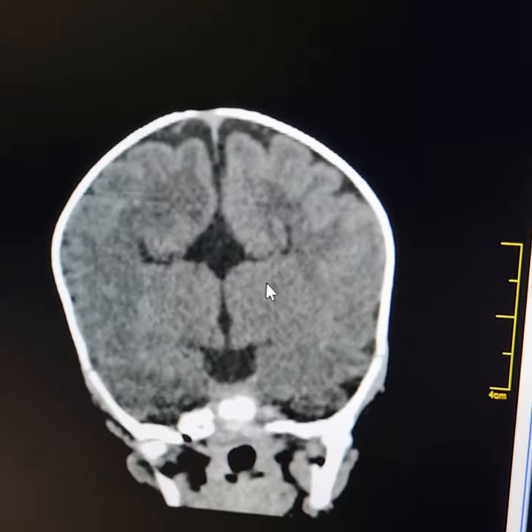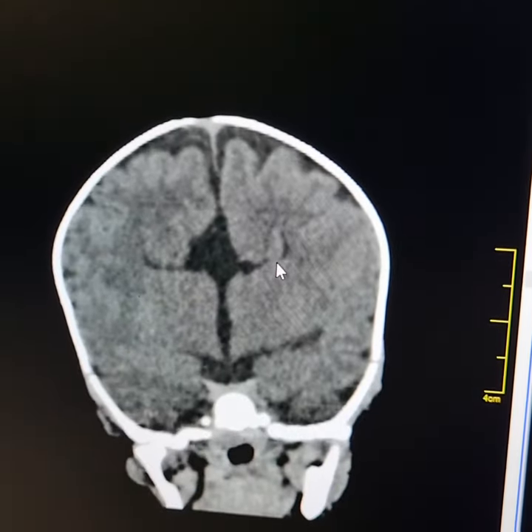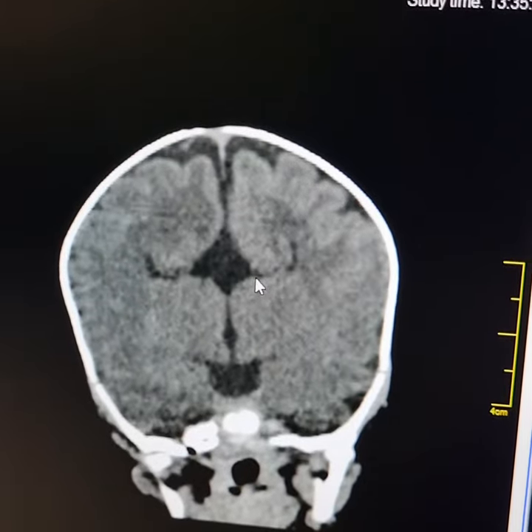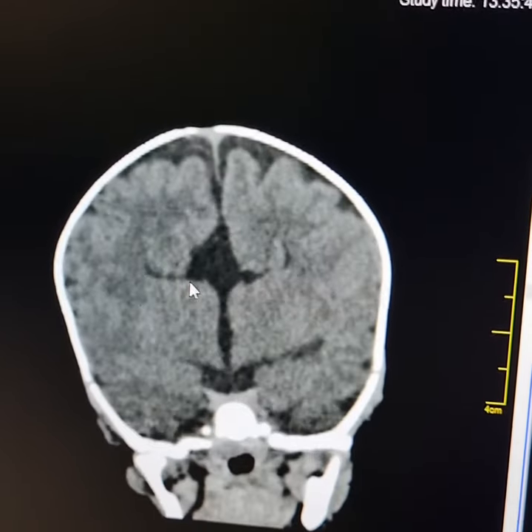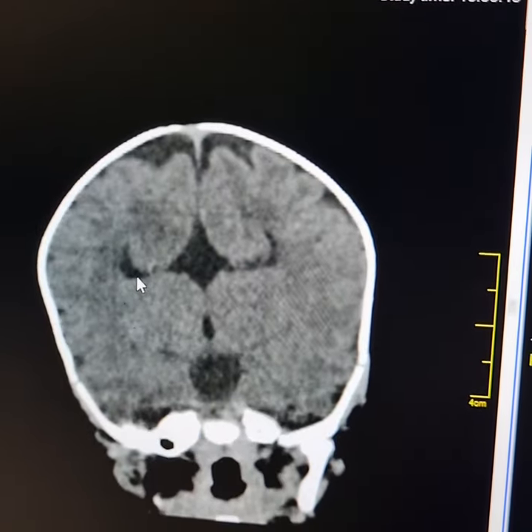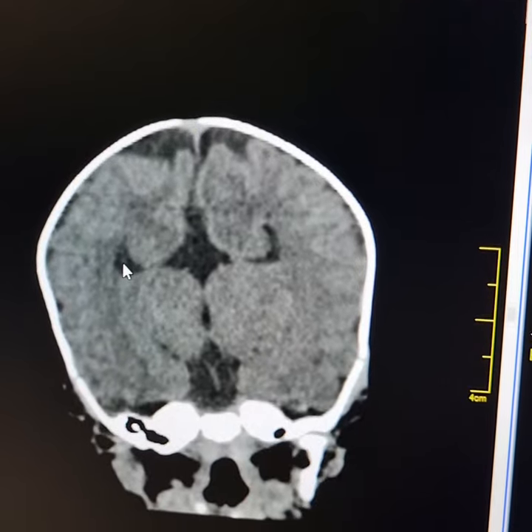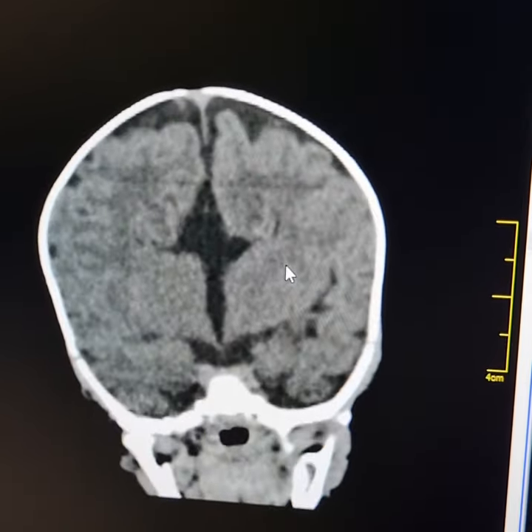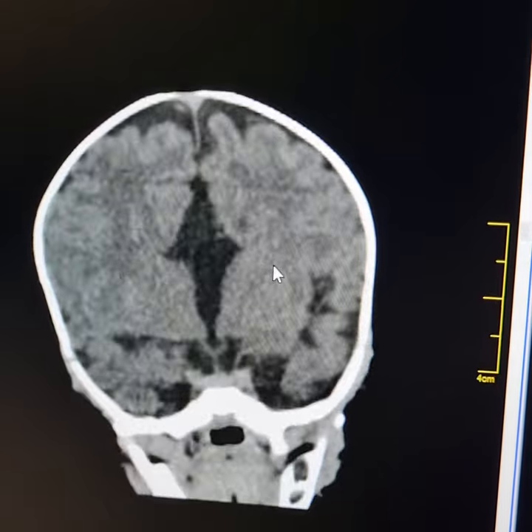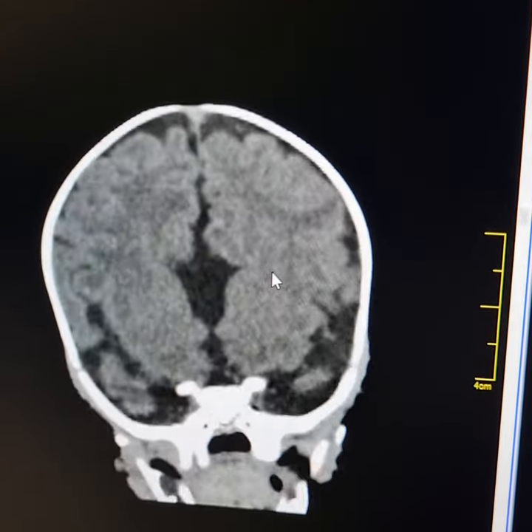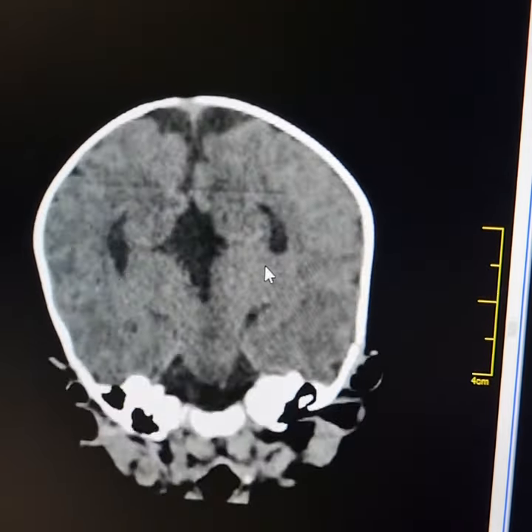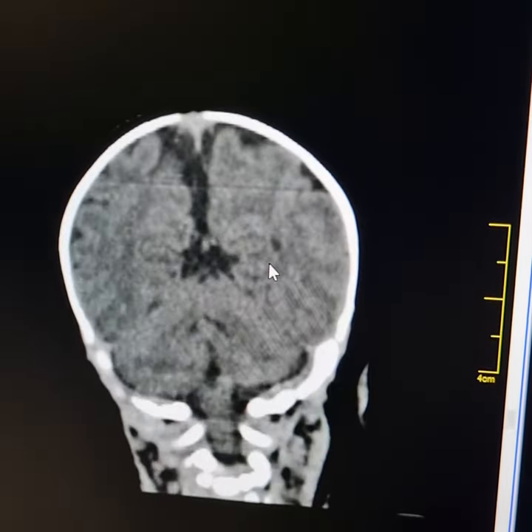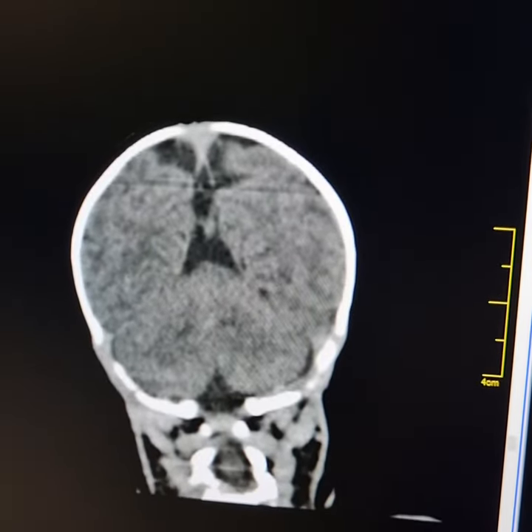Please observe that there is medial schizencephaly. There is a cleft here which extends medially up to the third ventricle. On the right side as well, there is a cleft which extends medially up to the dilated third ventricle, which typically ascends in between the cerebral hemispheres and gives an appearance of a cyst.